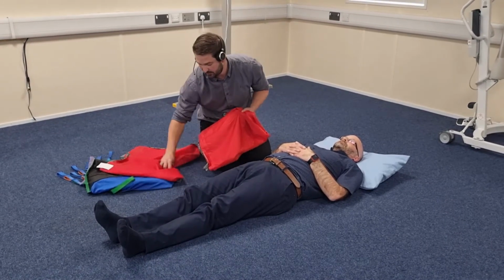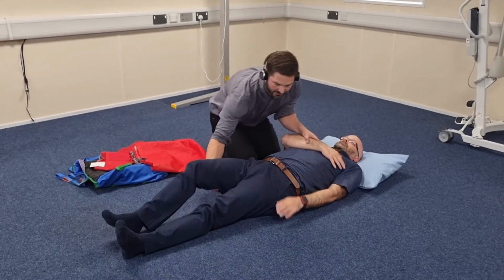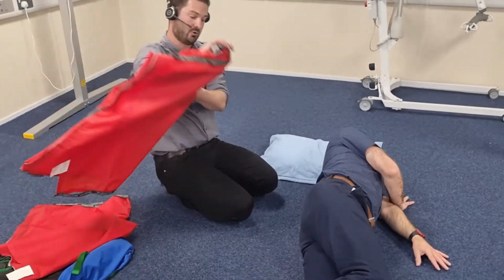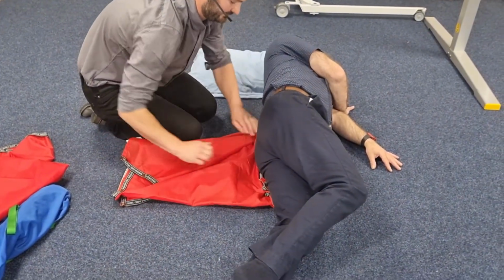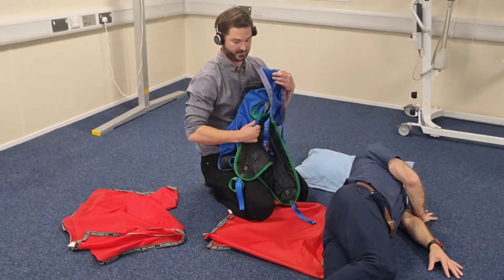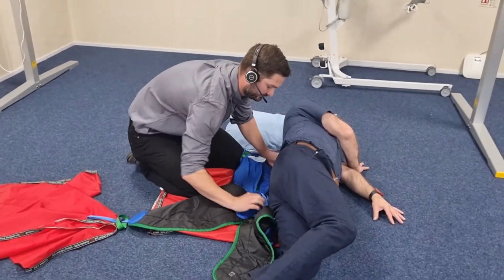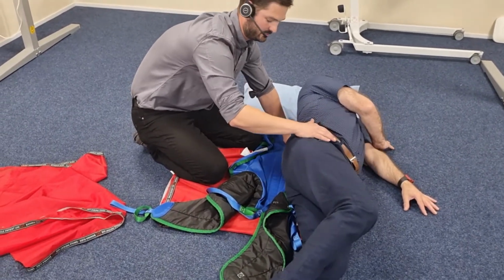Okay, so I'm going to begin by fitting the slide sheet. I'm just going to bring the person into a sideline position. I've then folded the flat slide sheet up. I'm just going to place this underneath the bottom, and then I'm going to introduce the full body sling. We use a full bodied sling because it provides support throughout the body when the person's been lifted up. So I'm just going to fit this underneath. I'm going to tuck it under the person's body and then bring them back onto it.